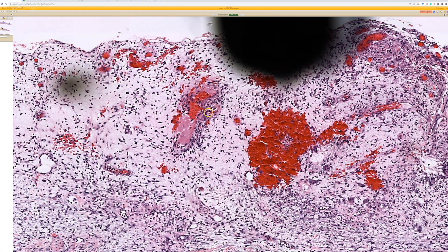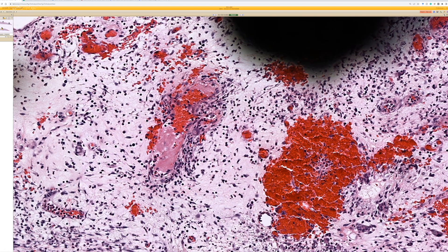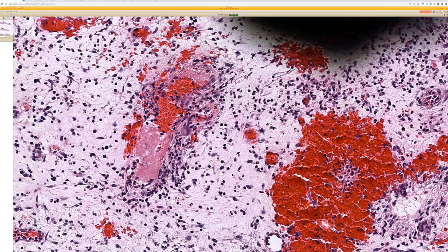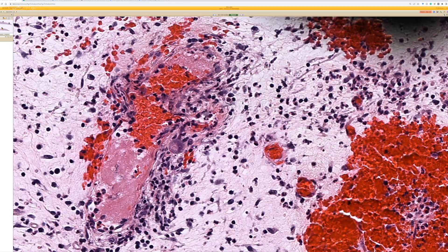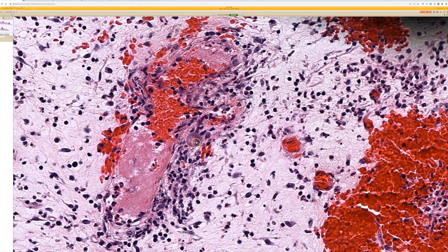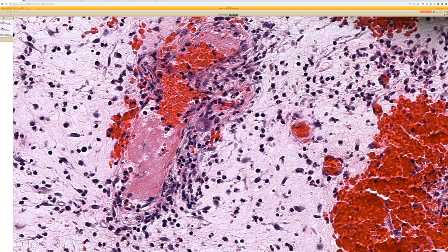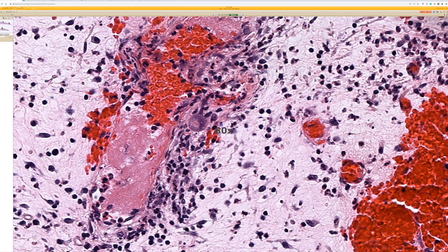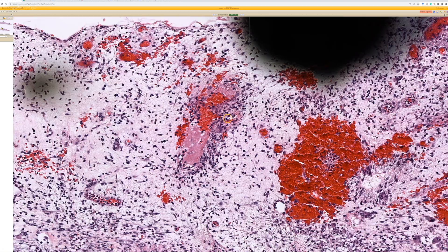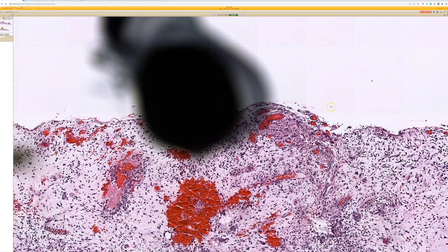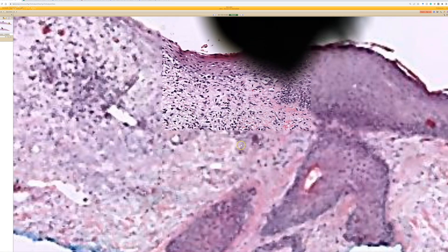We see some large endothelial cells with almost very little cytoplasm — kind of like those Alzheimer bodies. CMV. Yeah, there's a dot-like nucleolus or viral inclusion; sometimes it's hard to tell which. But it's a poor scan so we can't see it clearly, but there's a massive big nucleus right at the vessel wall, and looking around you can see there are more of the same.